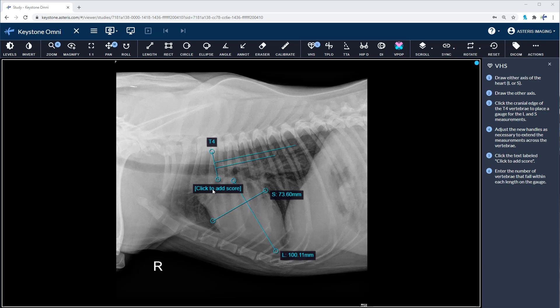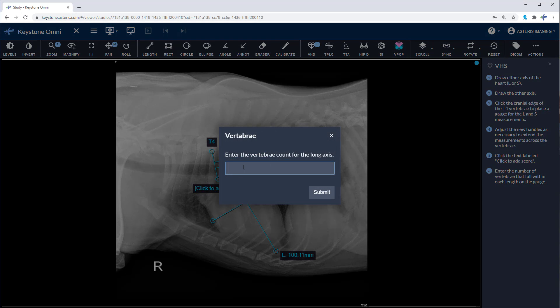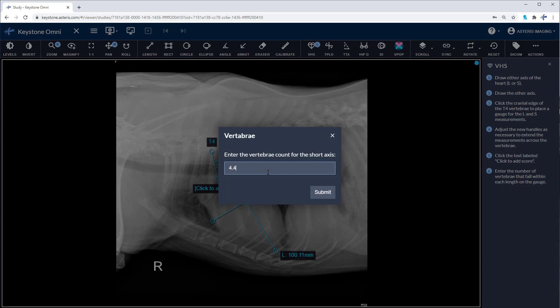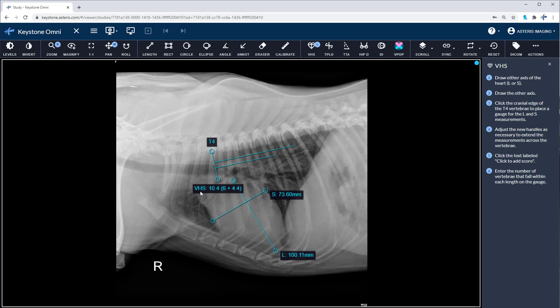Click to add the score. Enter in the amount of vertebrae you counted within the long axis. Allow Keystone to calculate the short axis for you — feel free to correct if needed. Click submit, and here is your vertebral heart score.